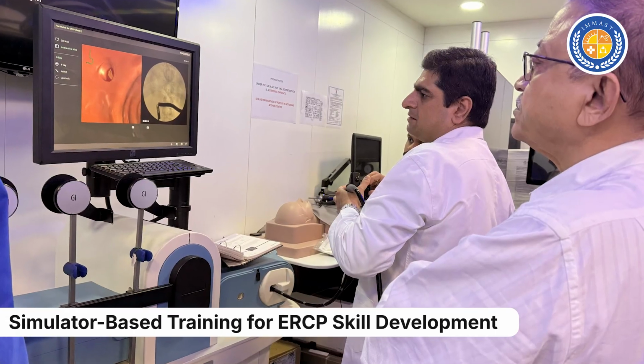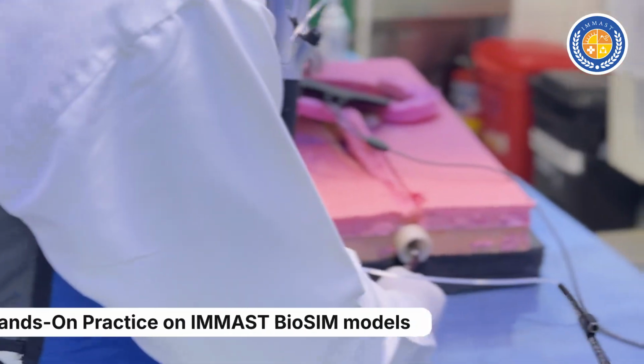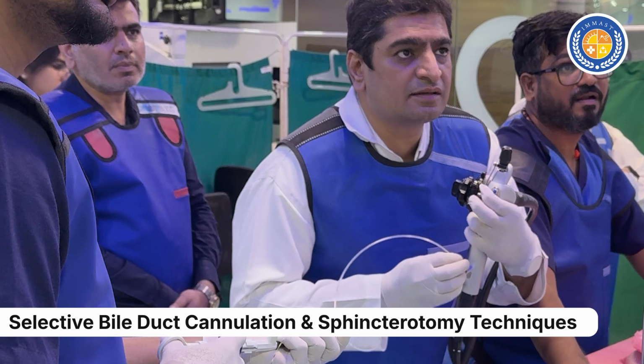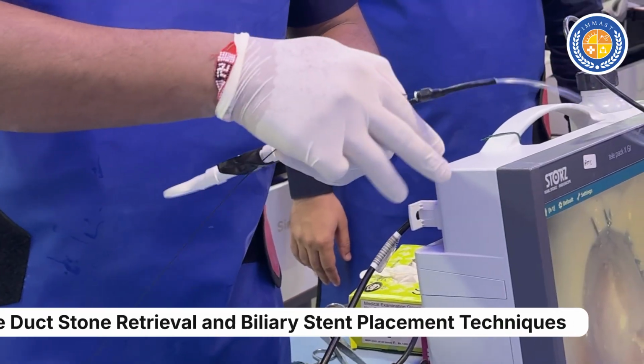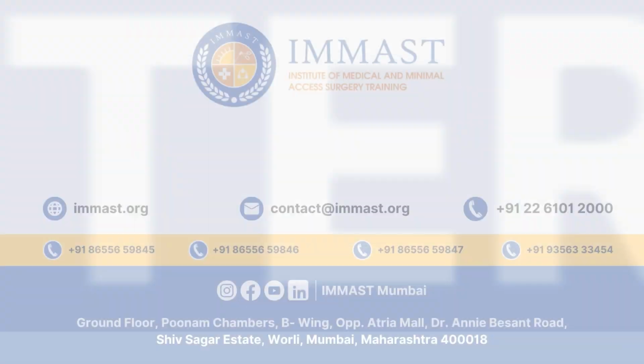There are simulators on which the candidates can practice, and we have also made a live tissue pig model so that you can practice selective cannulation of the bile duct, sphincterotomy, retrieval of stones from the bile duct, and insertion of biliary stents.